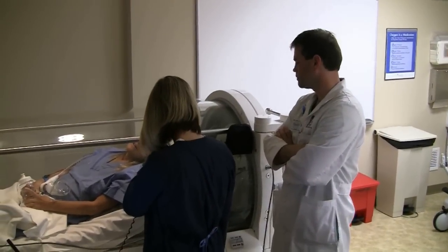Generally, a patient's treatment will last somewhere around an hour and a half to two hours. Patients come once a day, five days a week, generally for about 20 treatments. Then, if they're showing good signs of improvement or if they have healed, we may continue or may decide not to continue past that.